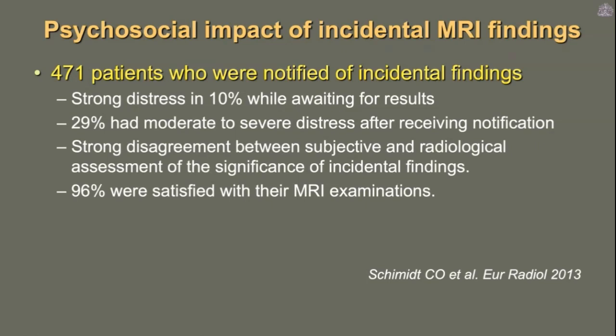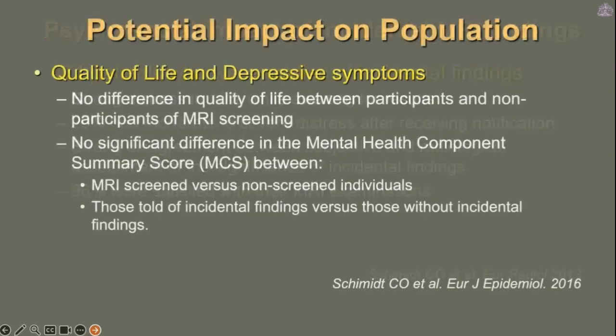What was interesting was that there was a strong disagreement between the subjective and radiological assessment of the significance of the finding. But really interestingly, 96% of them were satisfied with their MRI studies.